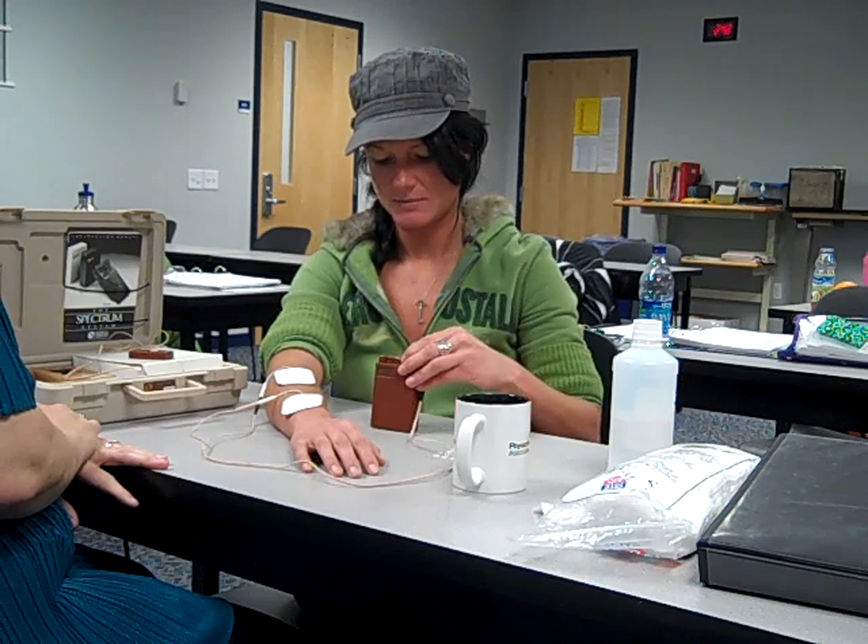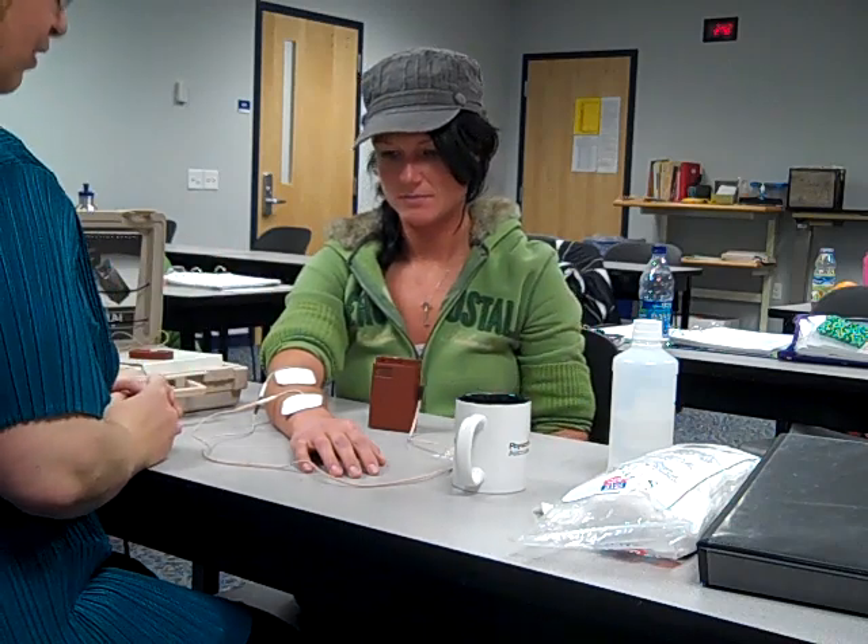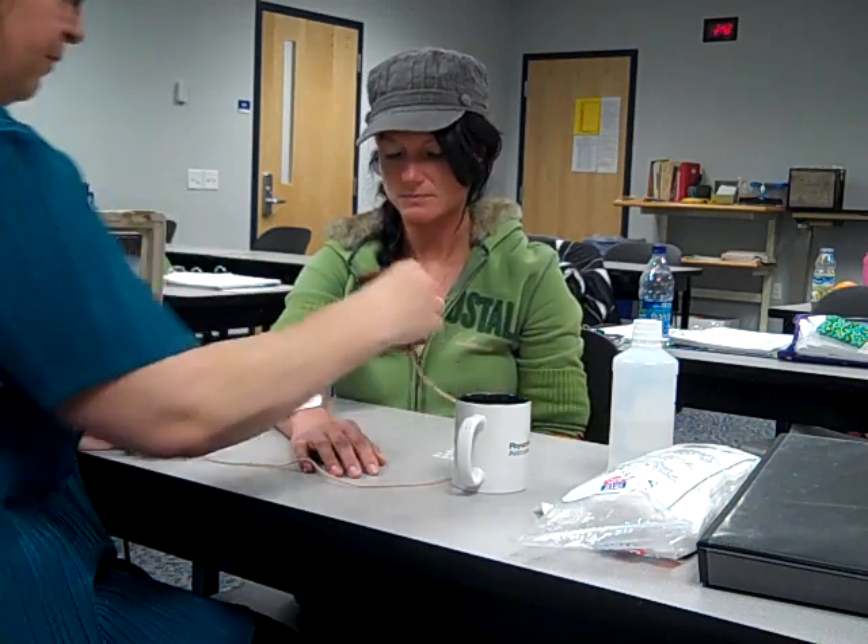Remember, you're going to take it up to where it starts to get uncomfortable and then turn it down right away to where it is comfortable. It probably helps if I don't tense that much. So that's comfortable right here? Yeah. What I'm going to do now — remember we talked about once we get everything set and the intensity is set, we're going to tweak the width? That's what I'm going to do now.